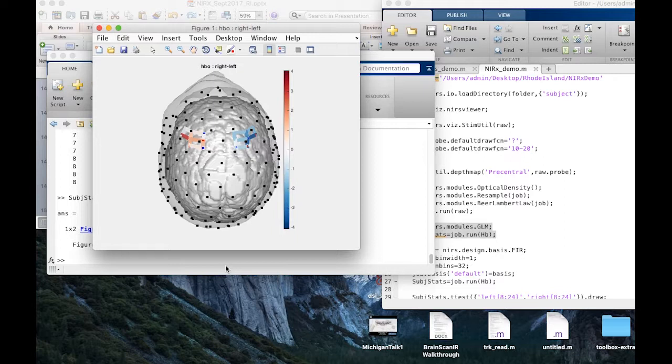But when we go to region of interest or image reconstruction, I can actually make use of the fact that oxy and deoxy are not independent measures, and I have that information available to me. So we do account for the fact that these five channels, the noise might have been correlated when we do a region of interest average, which I'm going to show you in a second. But right now I'm storing all the information for oxy deoxy. I'm not really doing anything with it. The cross terms, I should say.